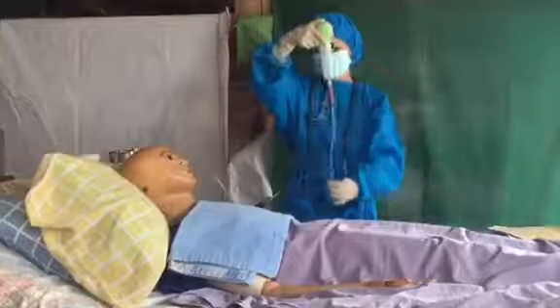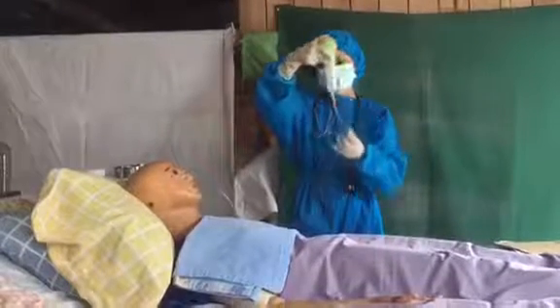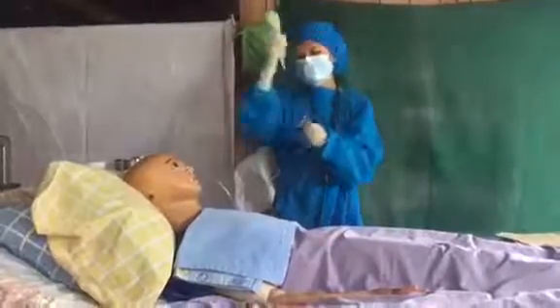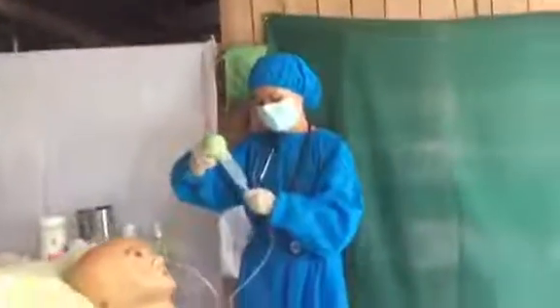then press and let it backflow. Okay, so lock the tube again and remove the asepto syringe and press the gastric contents into the kidney basin and put it back again into the tube.